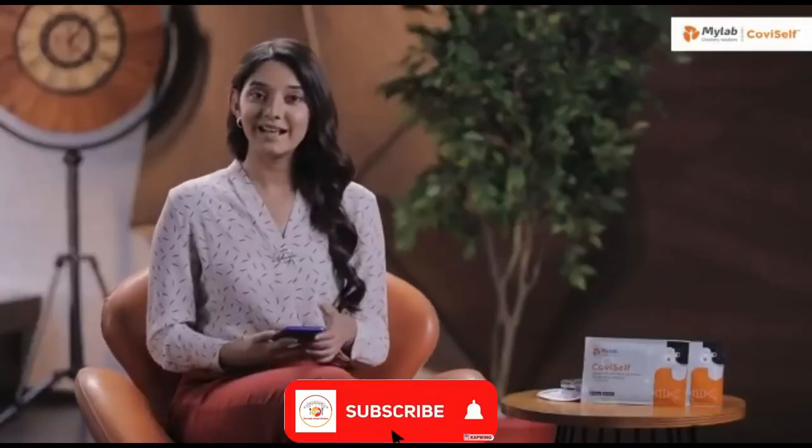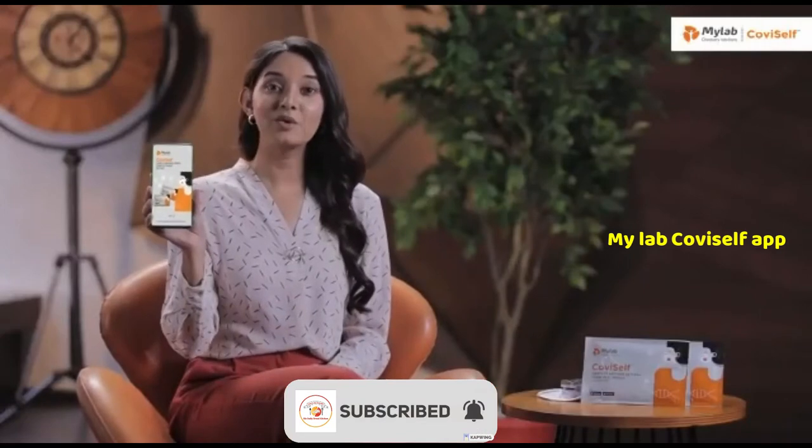Before you proceed with the test, please download the My Lab CoviSelf app either on Google Play or App Store. Fill in the credentials and then proceed with your test. The test preparations are now complete.